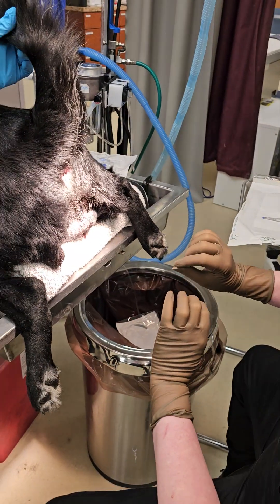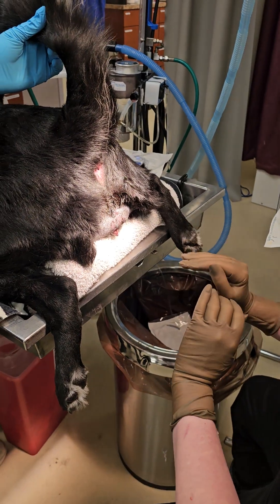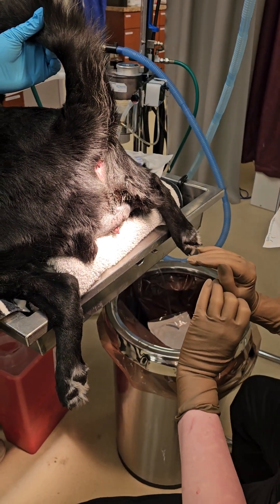So this area has already been prepped and shaved. I also put in some sterile lidocaine jelly.